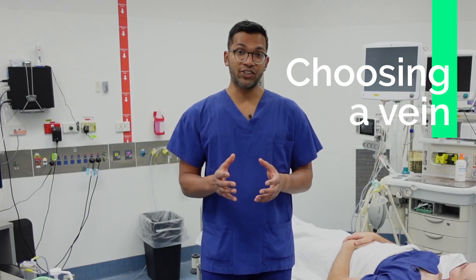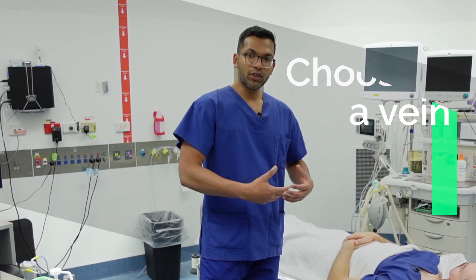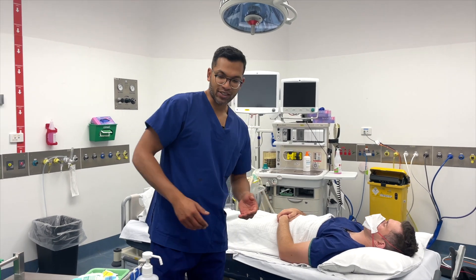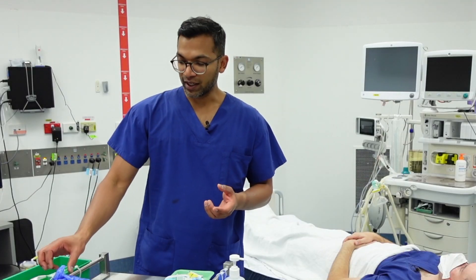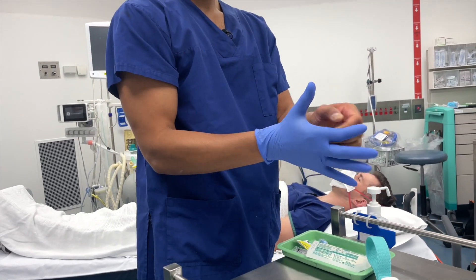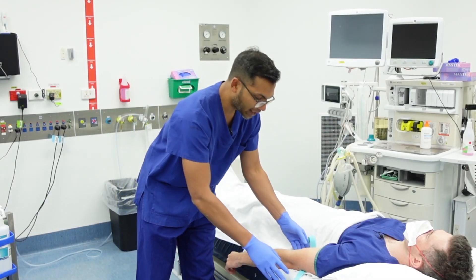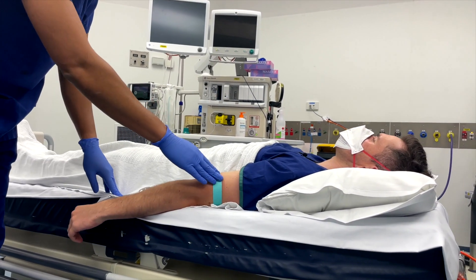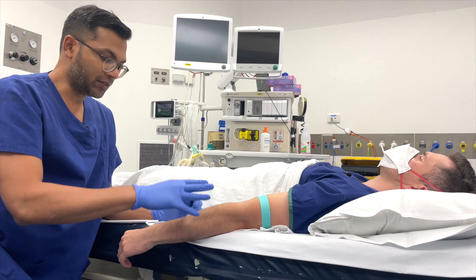Most of the time you're going to be asked to choose a vein on the arm. Before I touch a patient I always think about the five moments of hand hygiene by the WHO, so I always perform hand hygiene before interacting with the patient. I put on non-latex gloves to make sure patients don't have any reactions, because latex allergy is pretty common. The first thing I do is put on a tourniquet, and I do this even before setting up my equipment. I generally put it on the arm — not the forearm — so I have exposure all the way up and down from the arm, forearm, and hand.